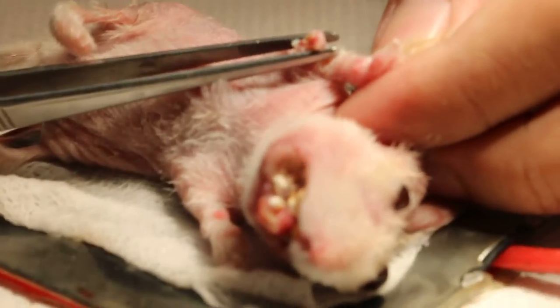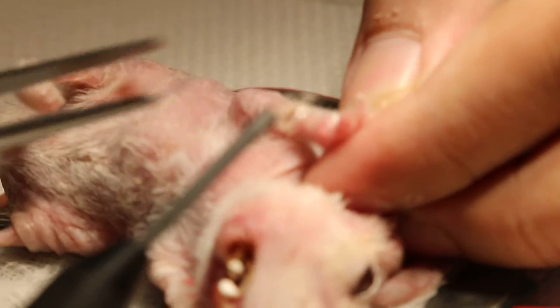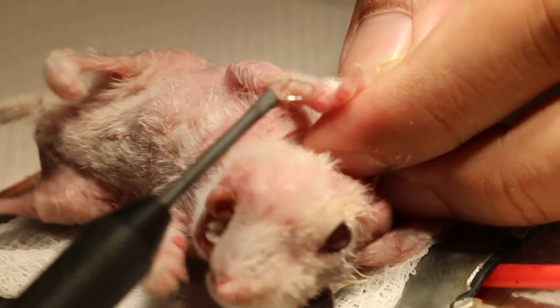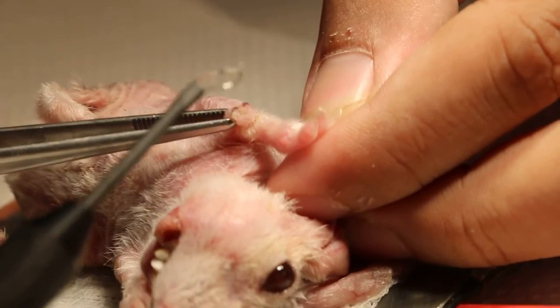The wart has been electro-excised. I was using the circular tool to lock off and take out the wart. You can see there's no bleeding — that's why electrosurgery is very good. There's no need to stitch either.